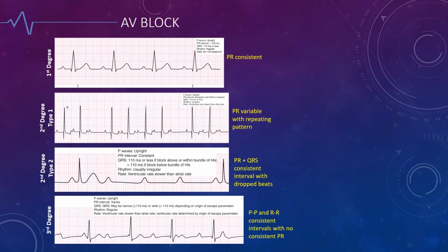All right? All right. AV block, this is always the hardest part. This is the one that people flunk the most on the test. It is the most difficult to recognize. First degree AV block is stupid. It shouldn't even be called an AV block because nothing is blocked. It's still making it through, okay? It should be called AV delay, not AV block. What it means is that from the start of the P wave to the start of the QRS is more than how many small boxes? More than 5 small boxes. Okay, done. Cross it off the list.